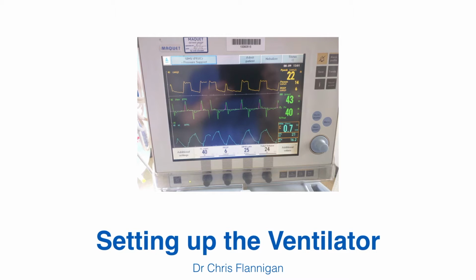There's a few things you need to tell it to do so it blows air into the patient the way you want it to. And the first thing you need to set is what gas you want it to blow into the patient, and you have a choice of room air, 21% oxygen to 100% oxygen, and anything in between. So that's your FiO2, your inspired concentration of oxygen that you can set on the ventilator. So what gas the ventilator blows into the patient.